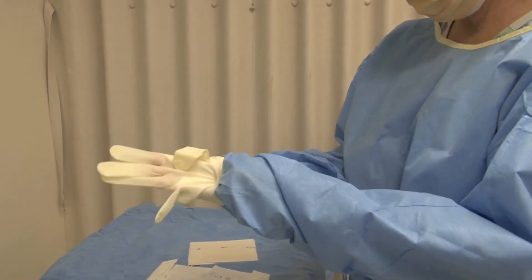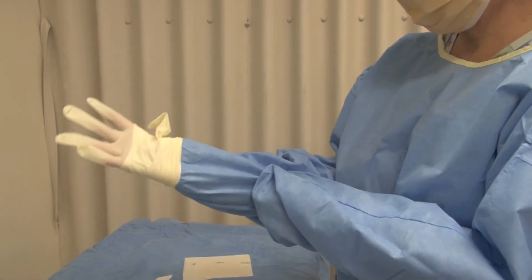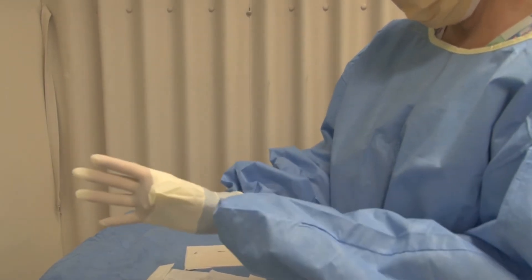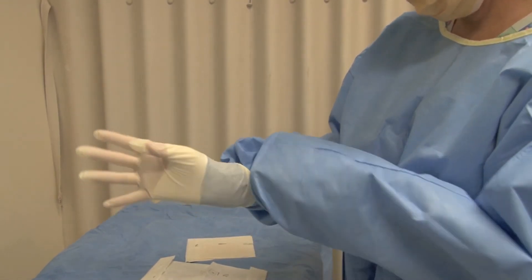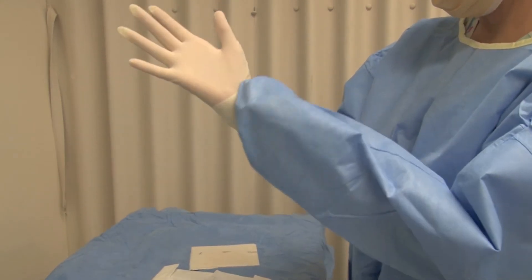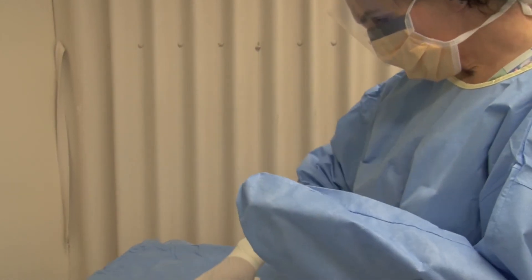Now I'm going to carefully pull the gown down slowly, making sure that the white cuff — see this white cuff — doesn't come out from under your glove. If you want to, without getting your fingers outside, you can pull that down. You can also hang on to the thumb piece and pull it — your thumb will fall in like that. Then carefully and gently pull the cuff of your gown so that the white cuff now sits at the bottom of your hand. Make sure the cuff at the bottom is still covered by the glove.